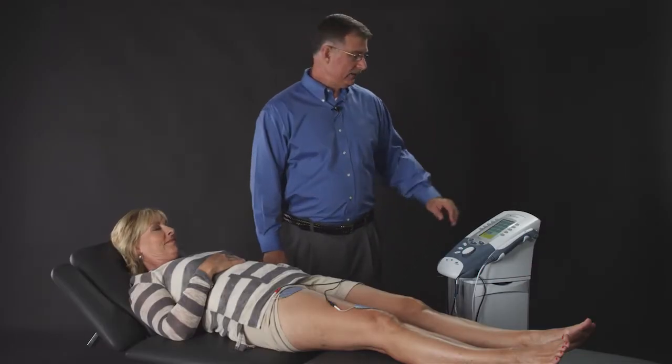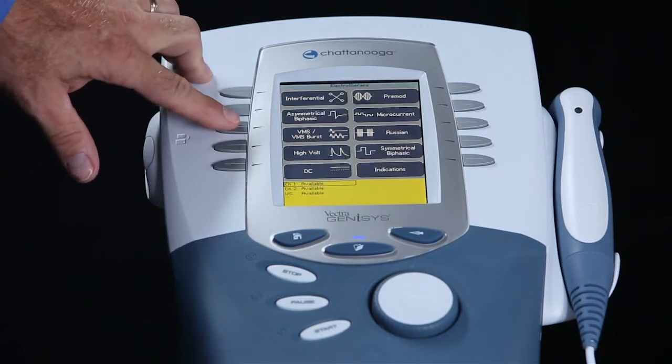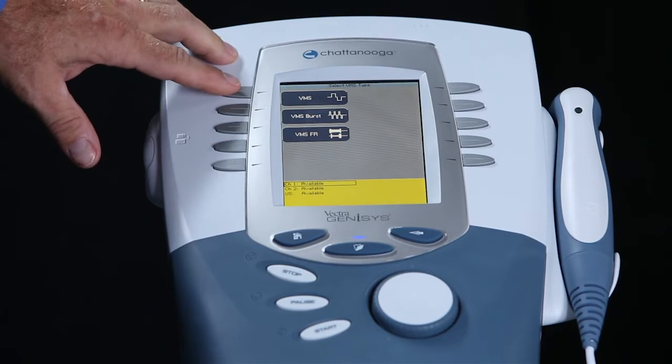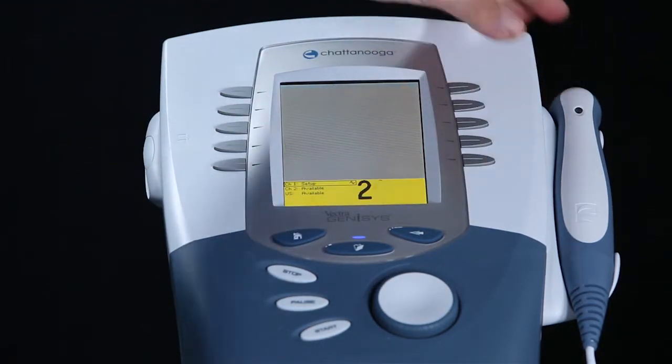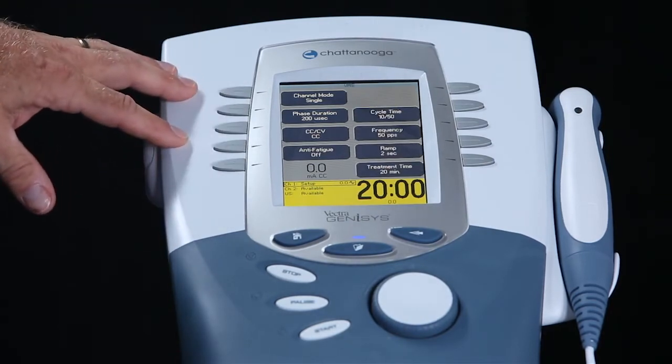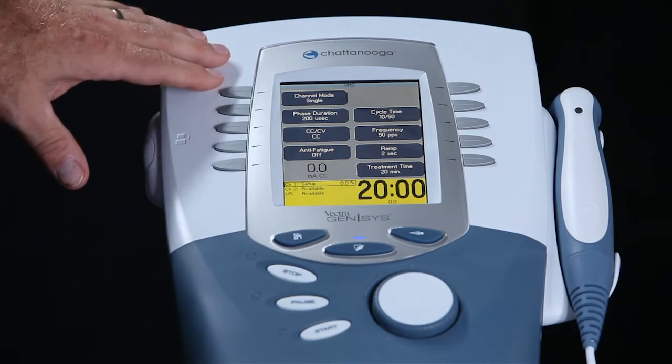Now let's go to the machine. The first button we'll press is the electrotherapy key. Then we'll press the VMS key, and we'll select the VMS waveform. We'll then press the edit key to display the parameters that are to be edited. We will edit the parameters again to get our most optimal muscle contraction.